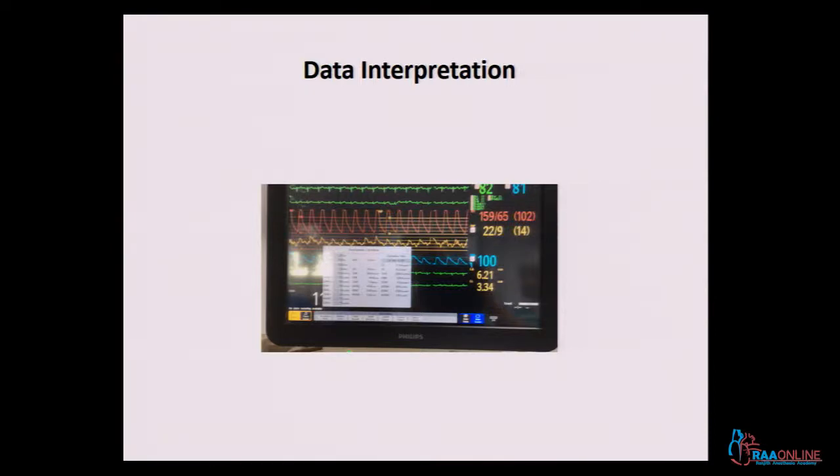We should have a thermodilution catheter. We can do the cardiac output, cardiac index. We put in the values, and all the parameters are there. The monitor will automatically capture the values. We only have to put in the PCWP value and the CVP value and perform the calculation. All the data will be there.